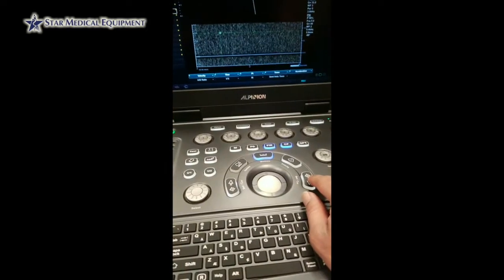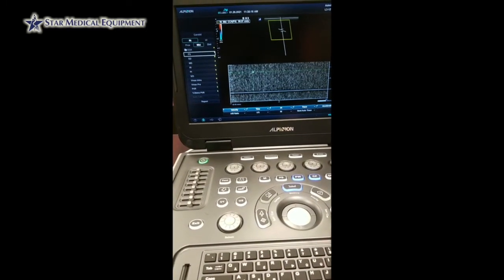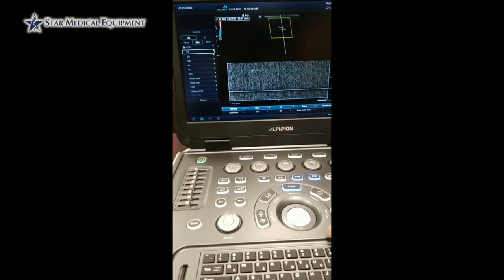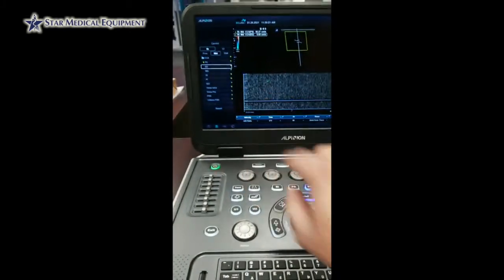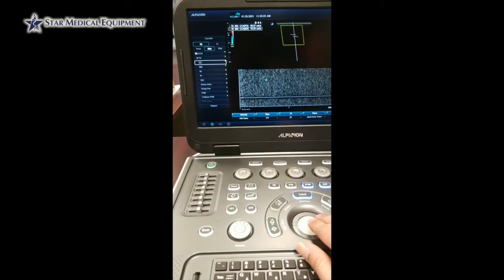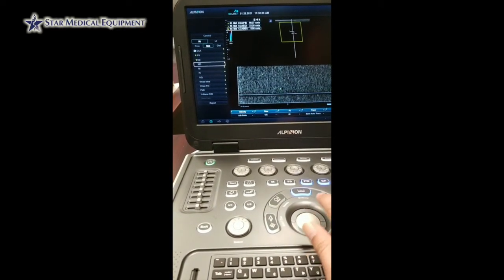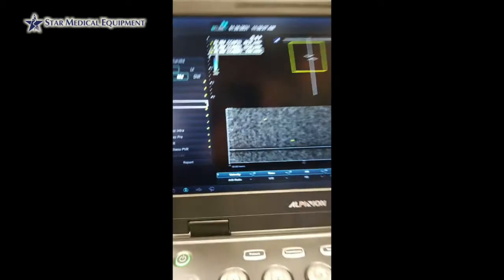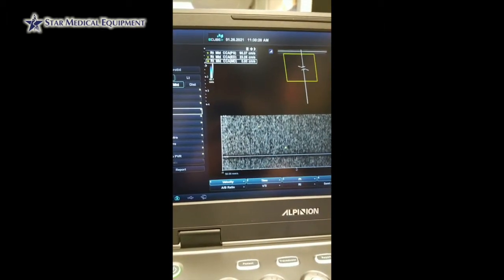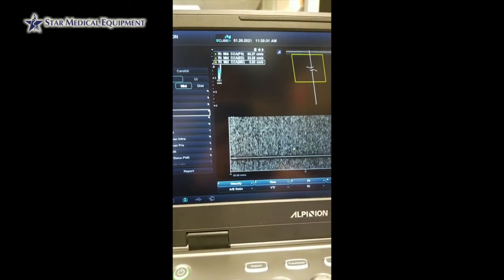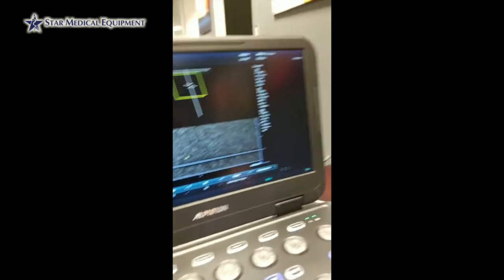So let's say this is the region where the peak systolic is — 90.37 centimeters per second — and it automatically jumps to the end diastolic. I press on the end diastolic, place the cursor, and it calculates. You can see the PS for the right mid CCA and the ED for that as well.